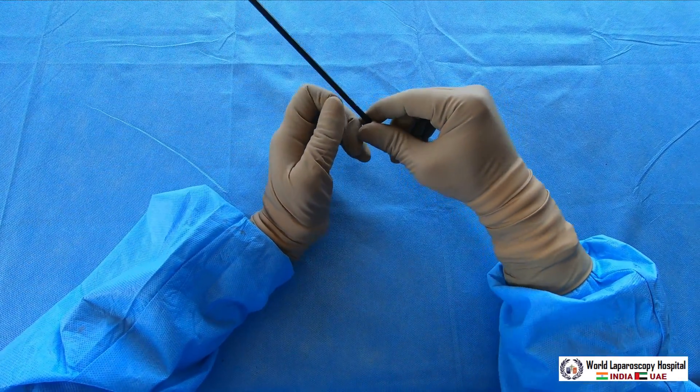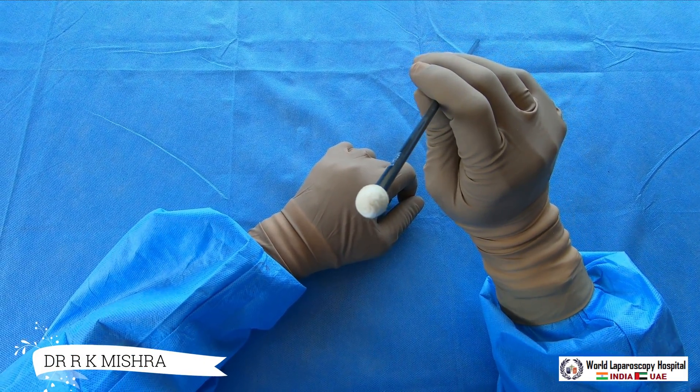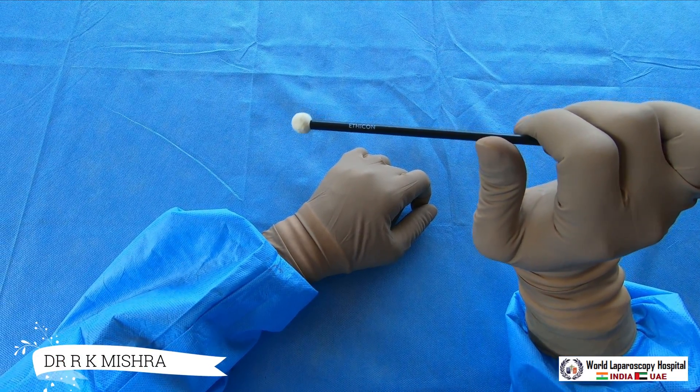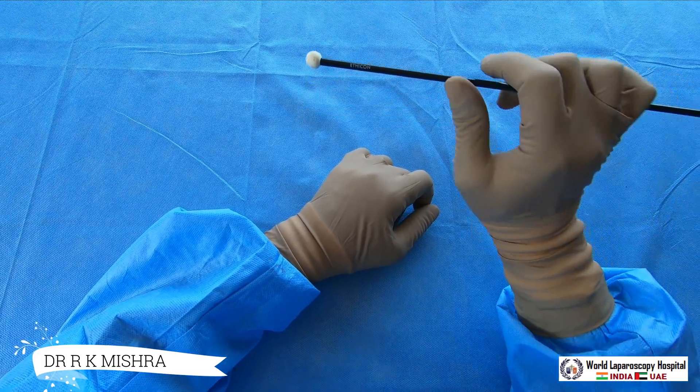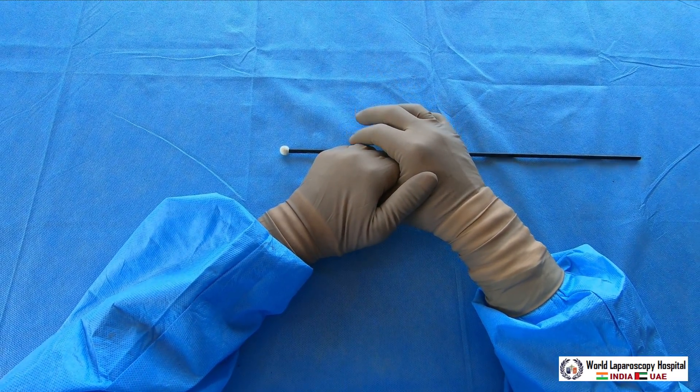So this is a simple but very useful instrument in laparoscopic surgery, called the peanut dissector or pledget. Many companies manufacture it, but this one is from Ethicon. Thank you very much for watching this video — have a nice day.